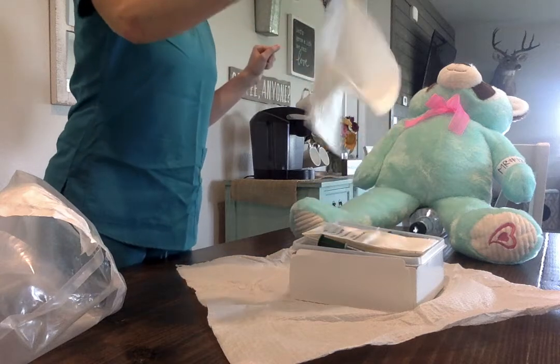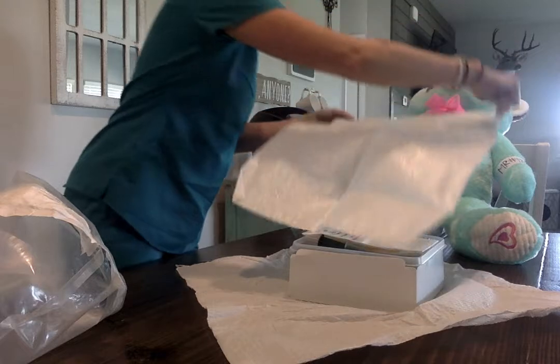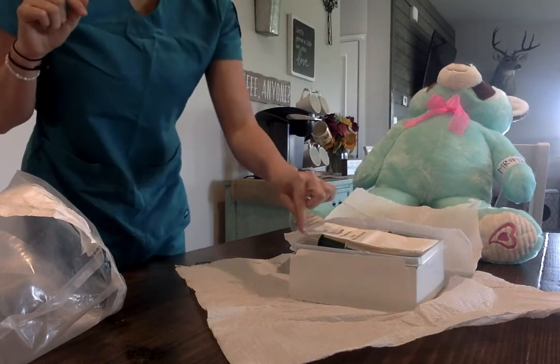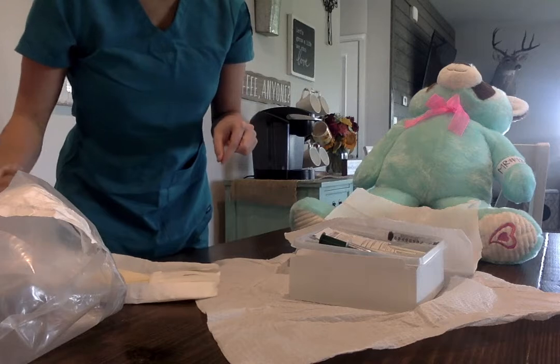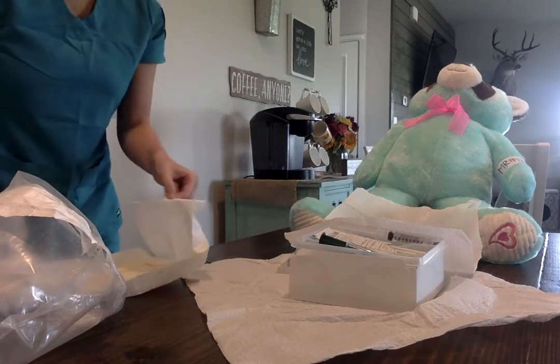Not touching anything. I'm going to make a drape. Just like that. Okay. Gloves. Turn it over here.